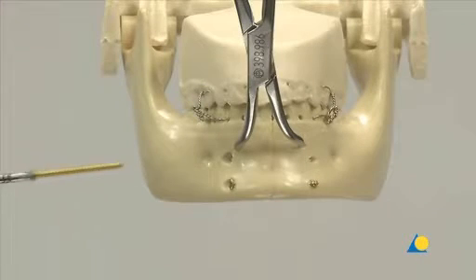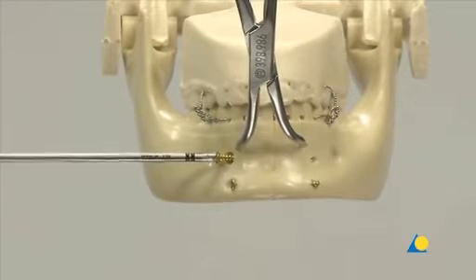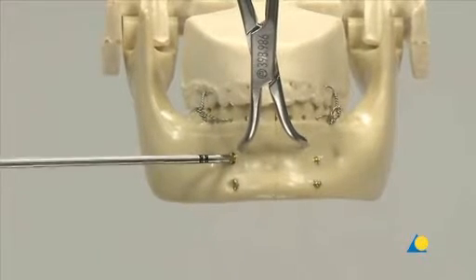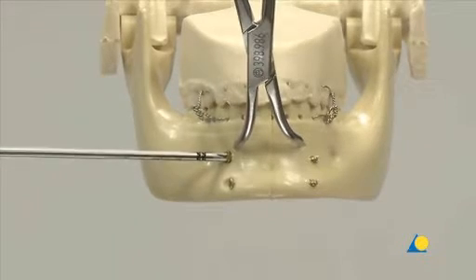A second screw, parallel and superior to the first, is required to prevent rotation of the fragments. The location for this screw has to be carefully selected so as not to harm dental roots or the mental nerve. This screw can be placed from either direction using the same procedure.